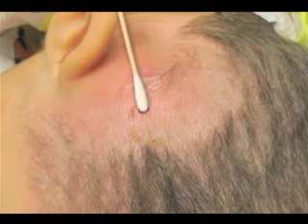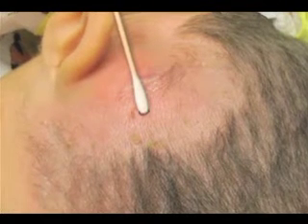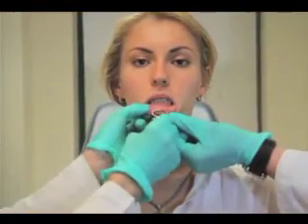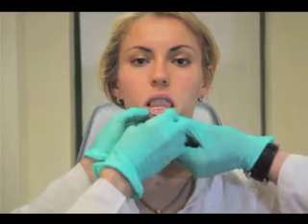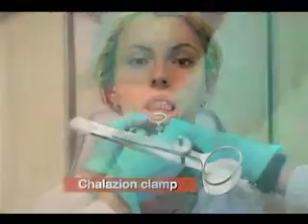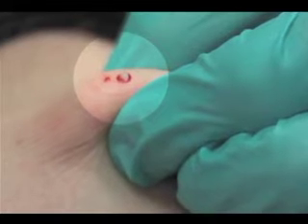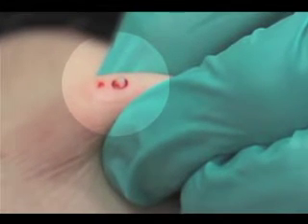The bleeding can be easily controlled with the application of pressure and the placement of the first suture. When performing a biopsy on the lip, which is highly vascular and extremely pliable, use a chalazion clamp to allow for easy handling and intraoperative hemostasis. In infants, the subcutaneous fat will push the specimen up, making it relatively easy to grab. Therefore, you will not need to punch much beyond the dermis.